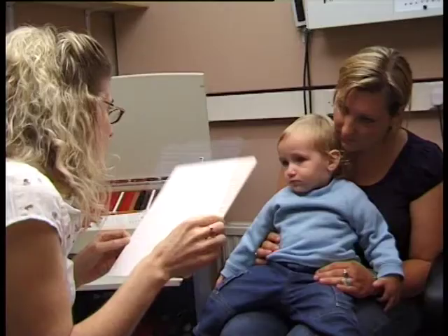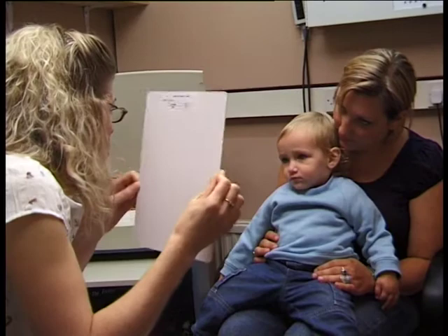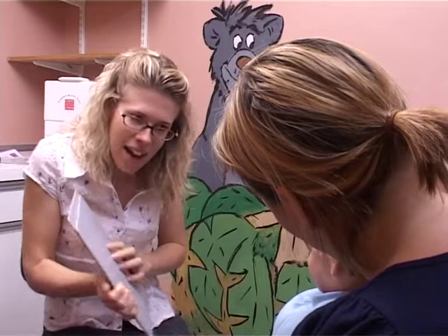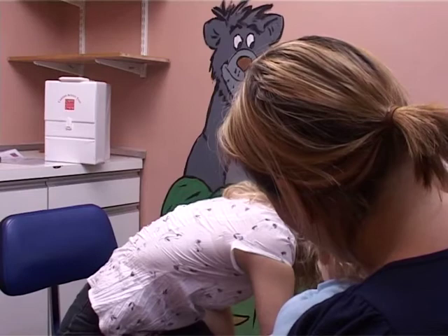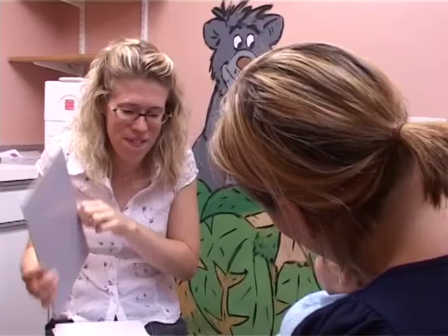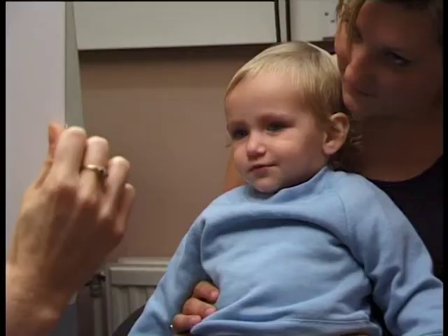Here's a useful tip: here's Helen with Oliver. Note how quickly Helen is lifting the card. When a small child sees the picture, he's not necessarily going to keep staring at it — often the child will look at the picture and then quickly glance away, usually to your face, and you can see that's exactly what Oliver is doing. If you raise the card too slowly, you'll miss the eye movement.